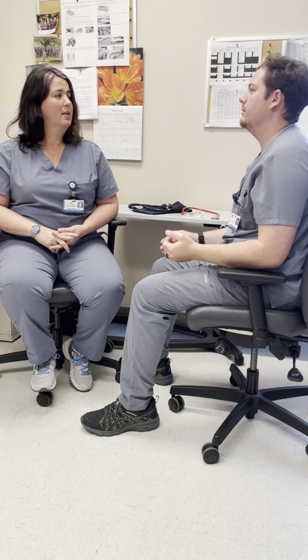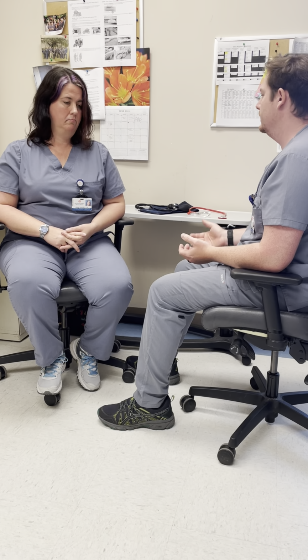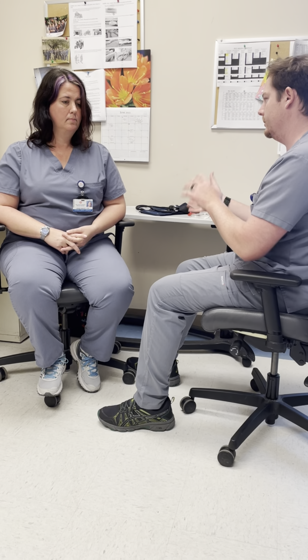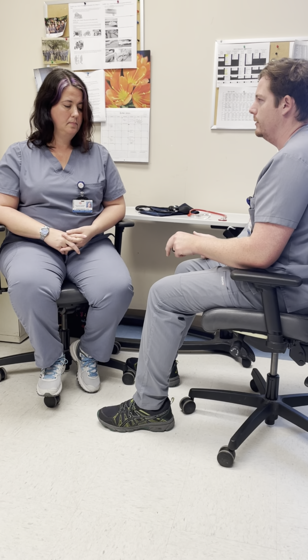So the next one we're going to do is blood pressure. When it comes to blood pressure, the normal range is around 120 over 80, so 120 systolic and 80 diastolic. But before we begin, we're going to check out what your occlusion point is. I'm going to put the blood pressure cuff on you, pump it up, and check your radial artery.